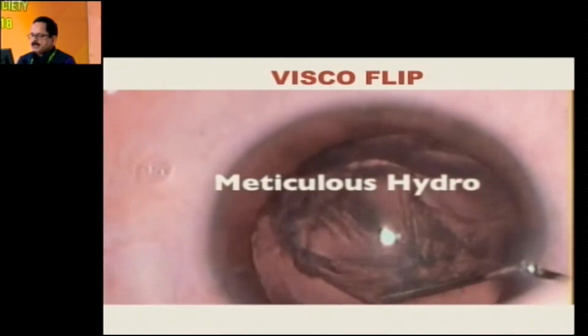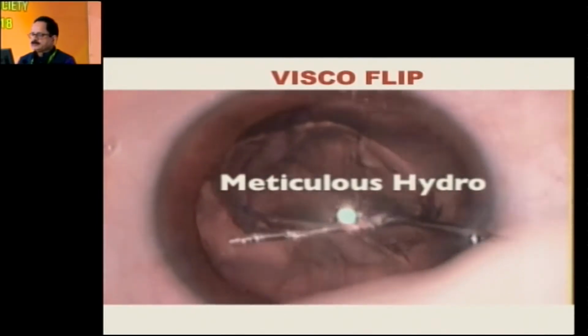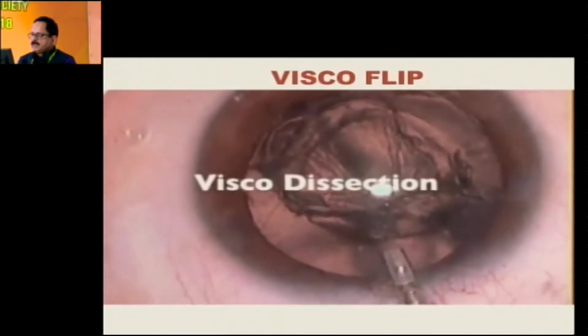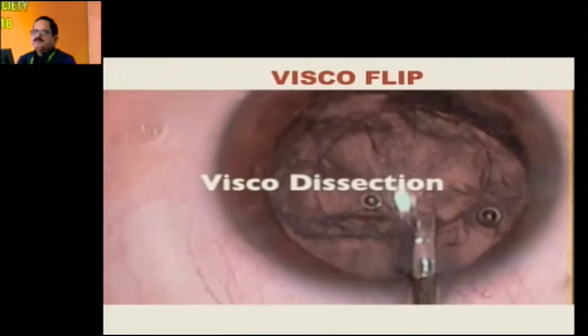So we are doing meticulous hydro from different sides. It should be very thorough. Now comes the time of visco dissection.